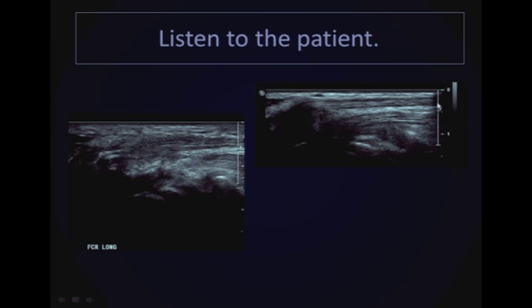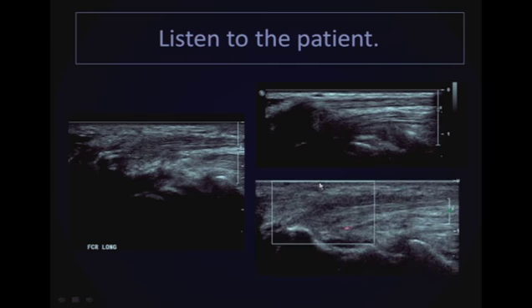In the other wrist, you can see that that normal architecture and normal ultrasound appearance persists through the whole tendon that we are imaging. We don't see thickening like we do see here. We can also use Doppler and see if there's any increased flow. We probably were scanning with a little bit of heavy hand here, but there was increased vascularity in this area. And this is insertional tendinosis or tenosynovitis of the flexor carpi radialis.